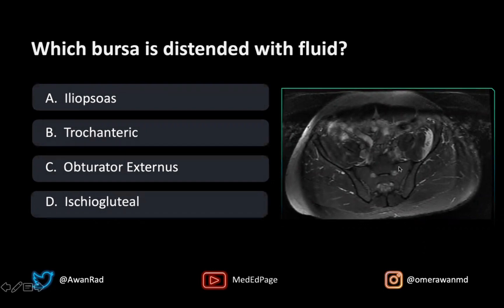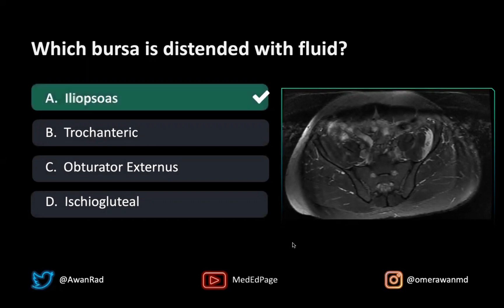If we take a look at this image, notice that the bone marrow signal is normal. This here is the sacrum, this is the right iliac wing, and this is the left iliac wing. But deep to the iliacus/iliopsoas muscle, there's fluid — a T2 bright signal distending a bursa. Notice on the right side there is no such fluid. Because it's deep to the iliopsoas and iliacus muscle, this is known as the iliopsoas bursa, and thus A is the correct answer.